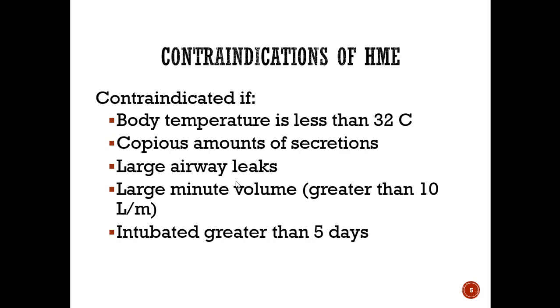If you have a very large minute volume, so if you have a patient that's very tachypneic or taking very, very deep breaths or a combination thereof, HMEs are not great devices for them because when they exhale, there's not really enough contact time for them to get enough humidity and heat into that device that it can recycle it properly. So when you're thinking about those patients that are breathing very fast or breathing very large tidal volumes, HME is not the greatest.